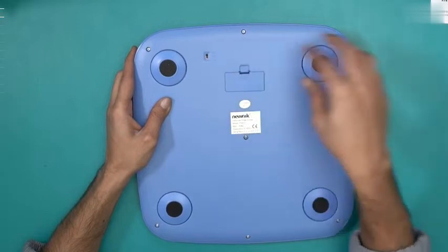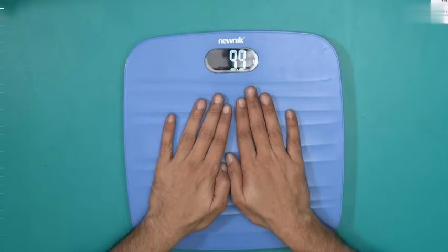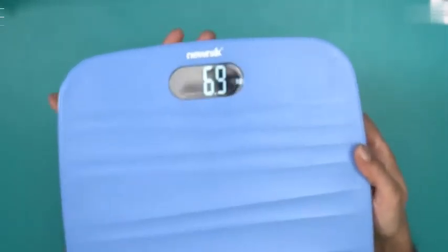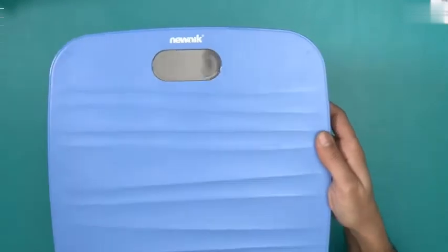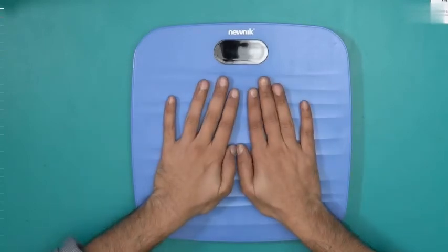There you go — we have display. If I put some pressure on it, you will see that it's giving me a number. It's showing 6.9 right now, and this one is in kilos. So if I want to change the unit, I just have to press the button underneath. I press it once and I will get the units — I should be getting the units in stone.